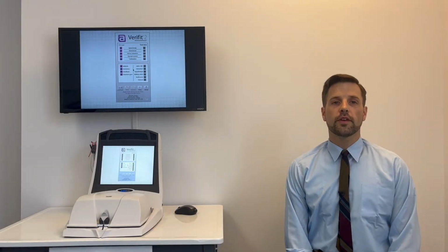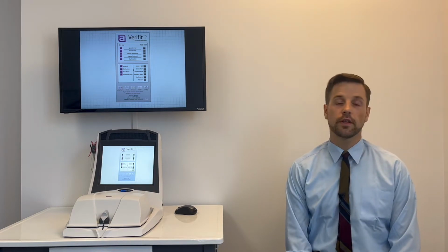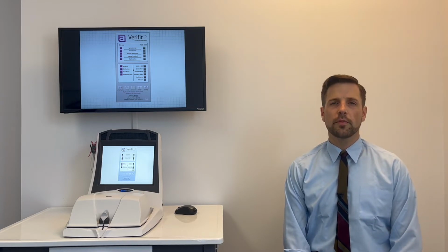If you're in one of the hearing healthcare professions, you're probably aware of Audioscan and the Verifit and the Verifit2. That's because Audioscan is the leader in North America for real ear measurement manufacturing. There's probably a couple good reasons for that.